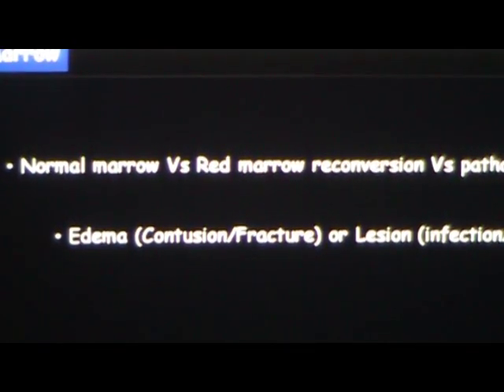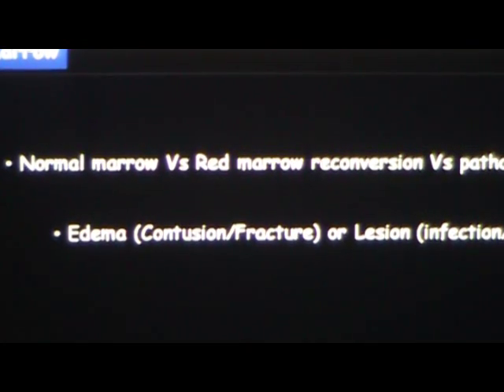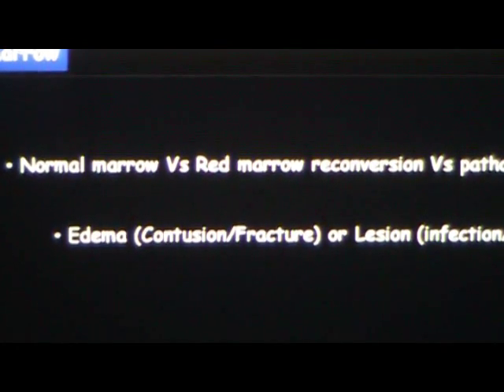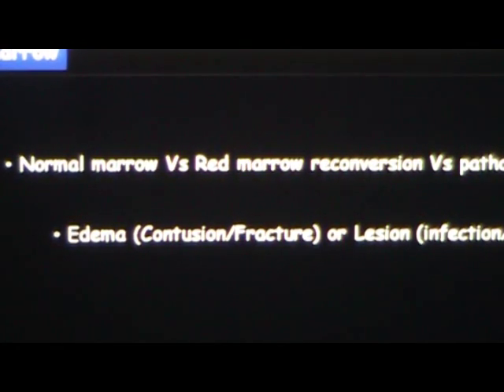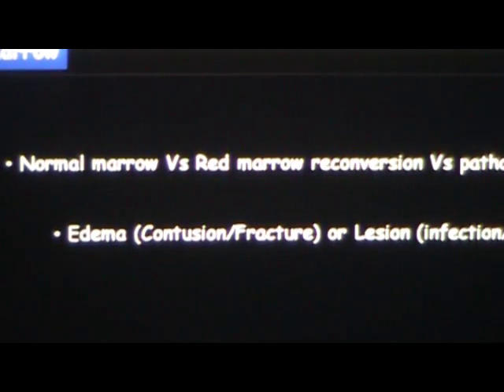When you look at marrow, first you have to decide: is it normal marrow? Is it abnormal marrow? Or is it just a variation like red marrow reconversion? That's the first thing to assess before you go into evaluating small structures.